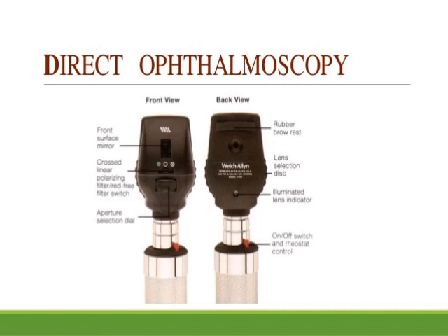Second is the direct ophthalmoscopy. It is the most commonly used method of fundus evaluation. The modern direct ophthalmoscope works on the basic optical principle of the glass plate ophthalmoscope, which was introduced by von Helmholtz.